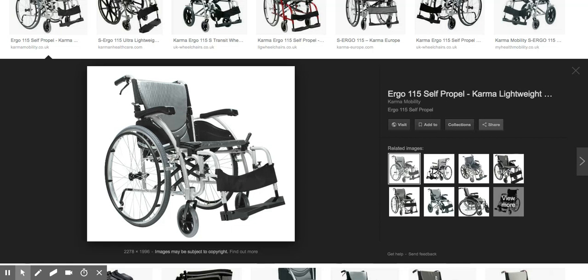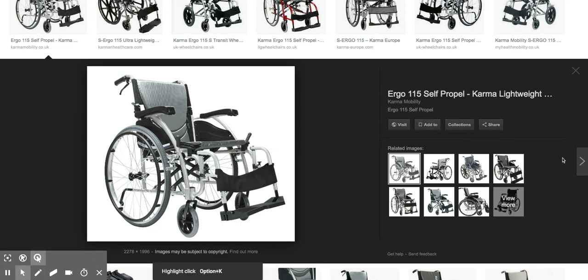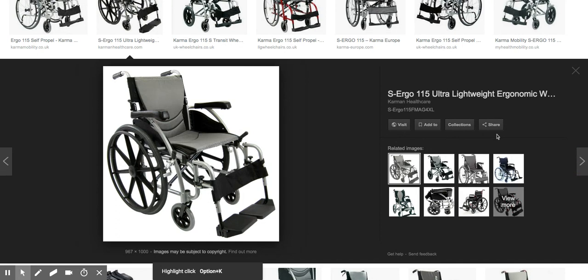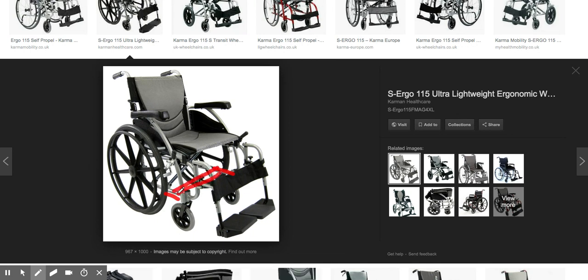Hi there, it's Scott from Invictus Active. This is a Karma 115 self-propelled wheelchair. I'm just going to take a look to see if the freewheel will fit. As shown in this diagram and photo, you can see there are two parallel horizontal bars — if your chair looks like this, the folding adapter will fit.